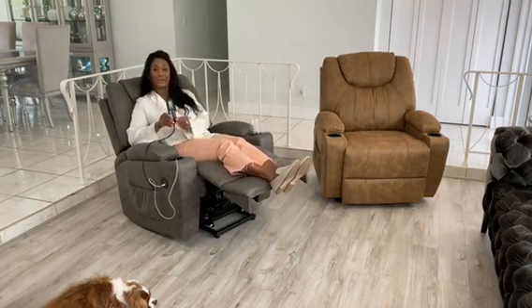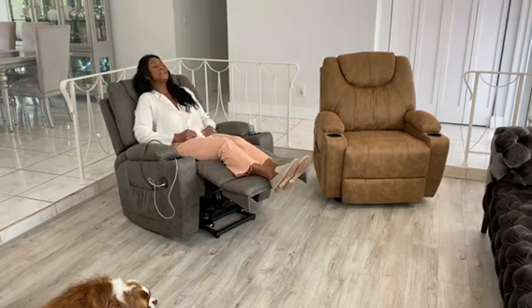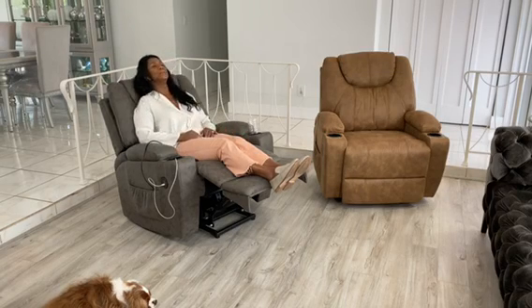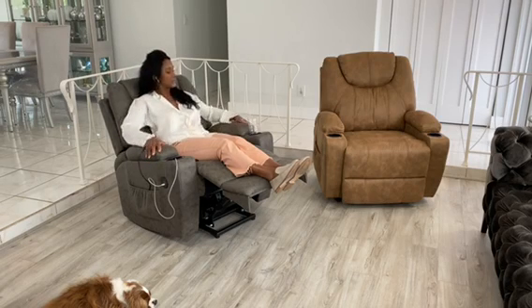Now I'm in the recline position. This is how you'll watch TV, watch your favorite movies. So comfortable. I appreciate the extra wide seat, which is so good and really, really sumptuous. Soft with the polyfill.